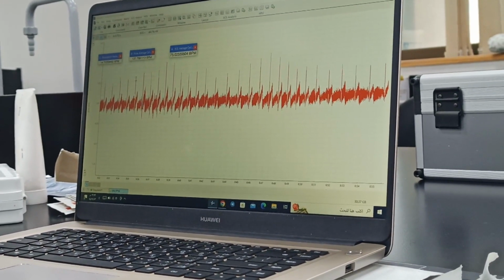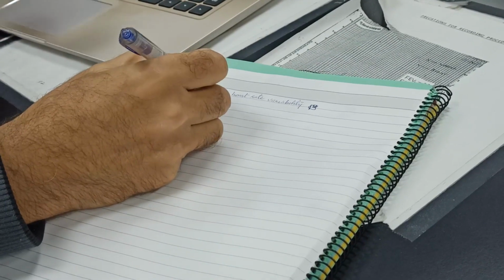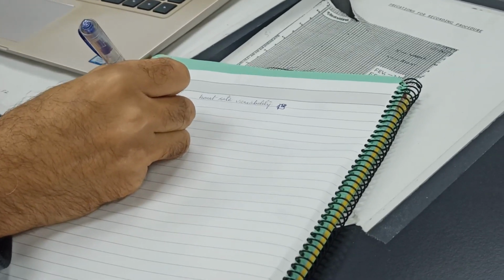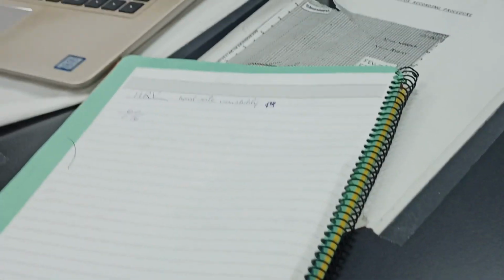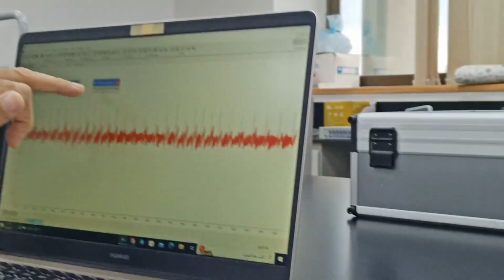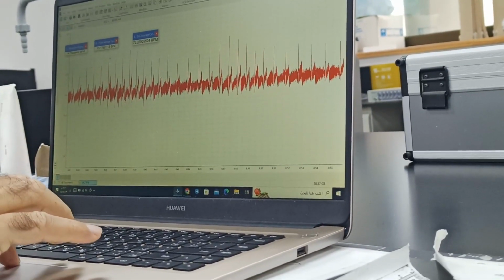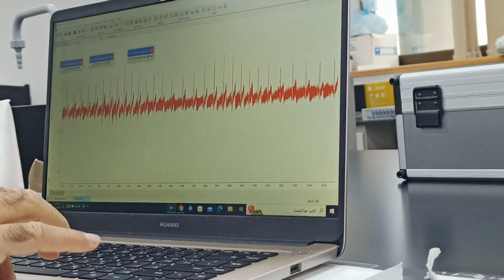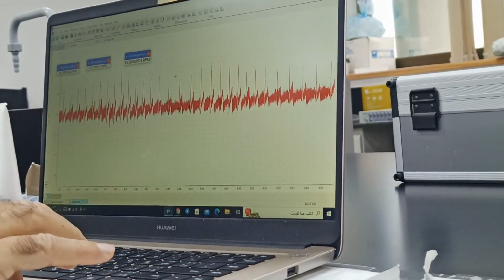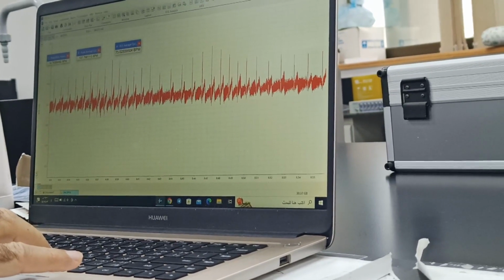This is what we call instantaneous heart rate, and we derive the heart rate like 60 over whatever the time interval is, say 0.76. So heart rate is something around, we can calculate, probably 75. And here it may be 78. Next it may be 80. 60 over what? 60 over 0.76. So exactly what it is.